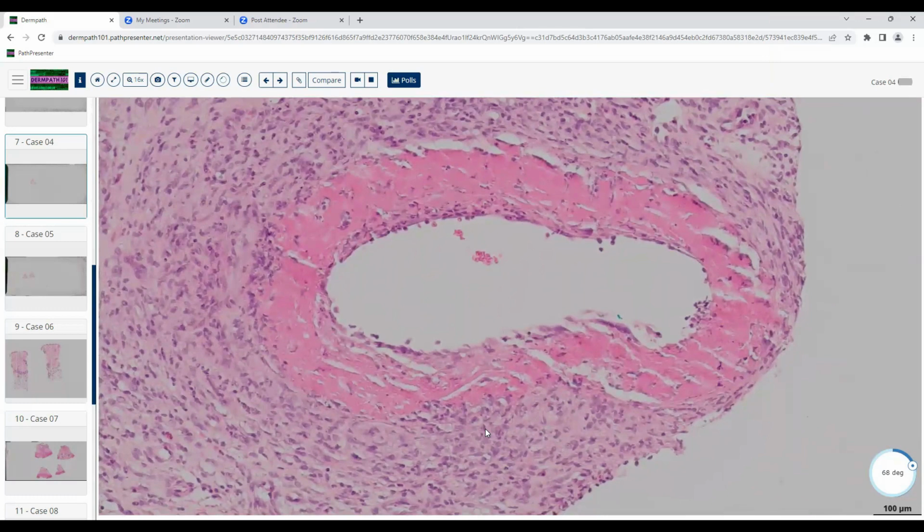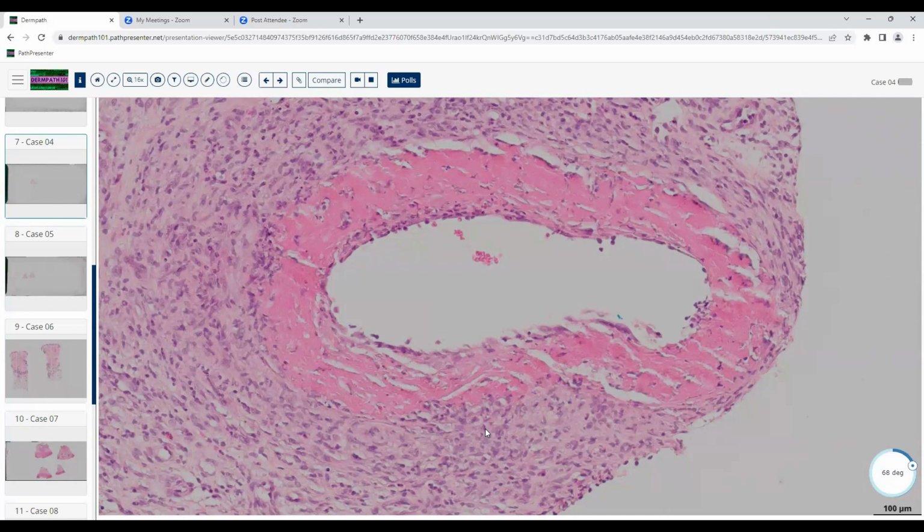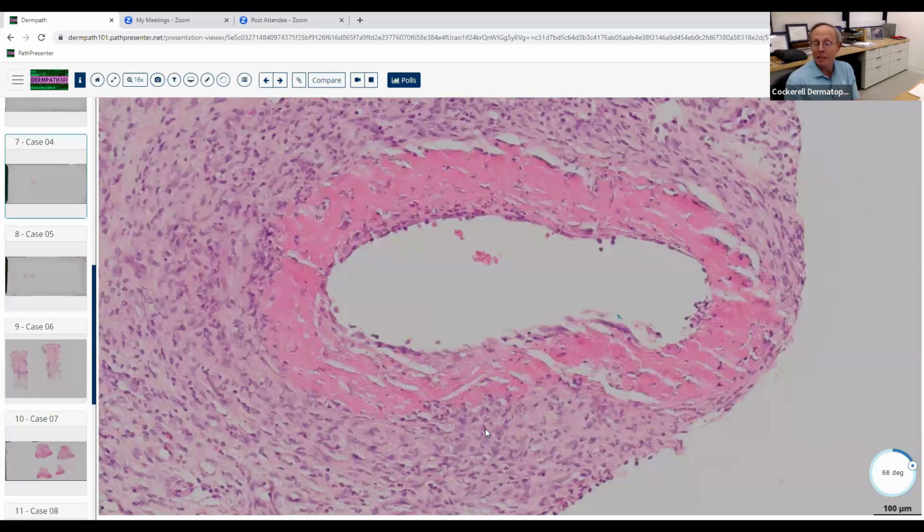Like a granulomatous vasculitis. Yeah. What are a couple of diseases that give you granulomatous vasculitis? Like I think tuberculosis, like erythema induratum. Usually not granulomatous vasculitis, though. That's usually more of a diffuse pattern with nodular aggregations of cells surrounding pre-existing blood vessels, usually neutrophils, eosinophils, eventually fibroplasia. So that doesn't usually give you granulomatous vasculitis. But there's a couple of entities that can, not too many.